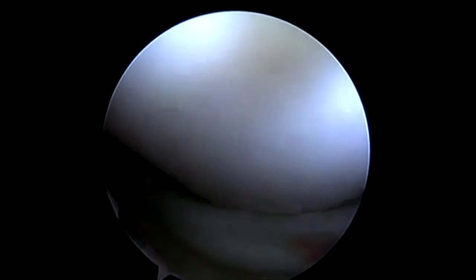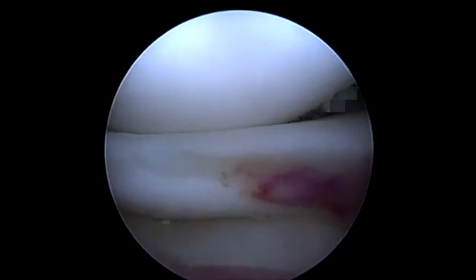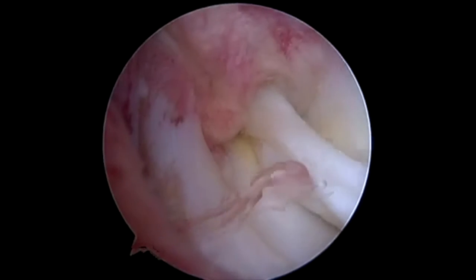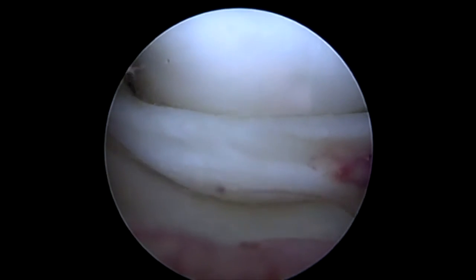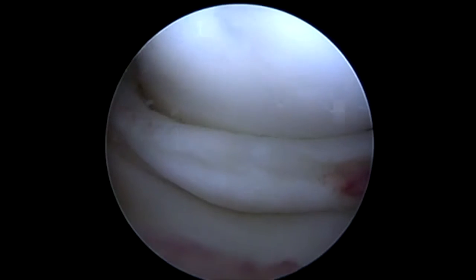Here we're looking at a medial meniscus bucket handle tear that's flipped, which we're going to repair with our NovaStitch Plus. I'm looking at the backside of the meniscus right now, visualizing from my lateral portal. We can see that we've got a nice intact meniscus and this is an acute tear, so we should be able to repair it.